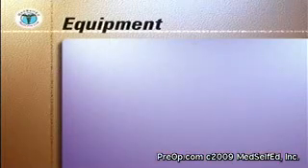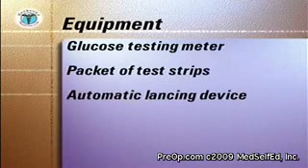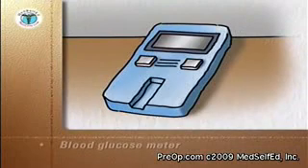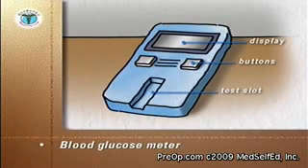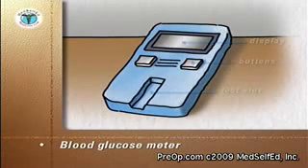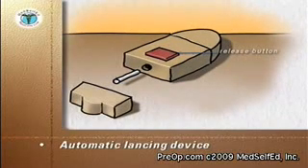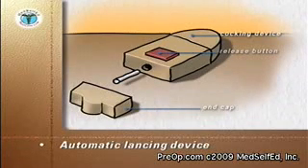The equipment you will need to assemble includes the glucose testing meter, a packet of test strips, an automatic lancing device, and facial tissue. The meter will have a display with blood sugar readings as shown, an on-off power button, and a slot into which the test strips are inserted. In the back of the meter will be a compartment for batteries. The automatic lancing device has three components: the body with a release button, lancet holder, and cocking device, the removable end cap, and a separate short lancet.